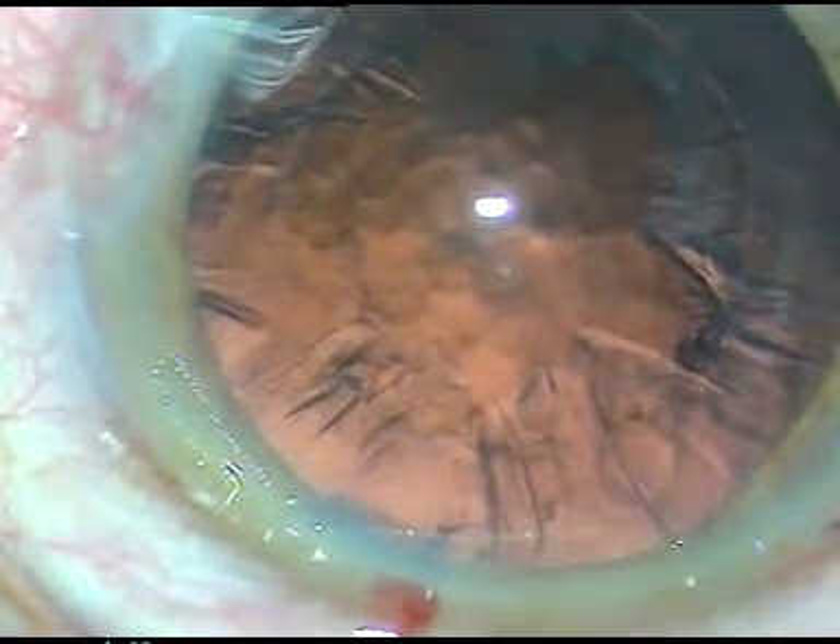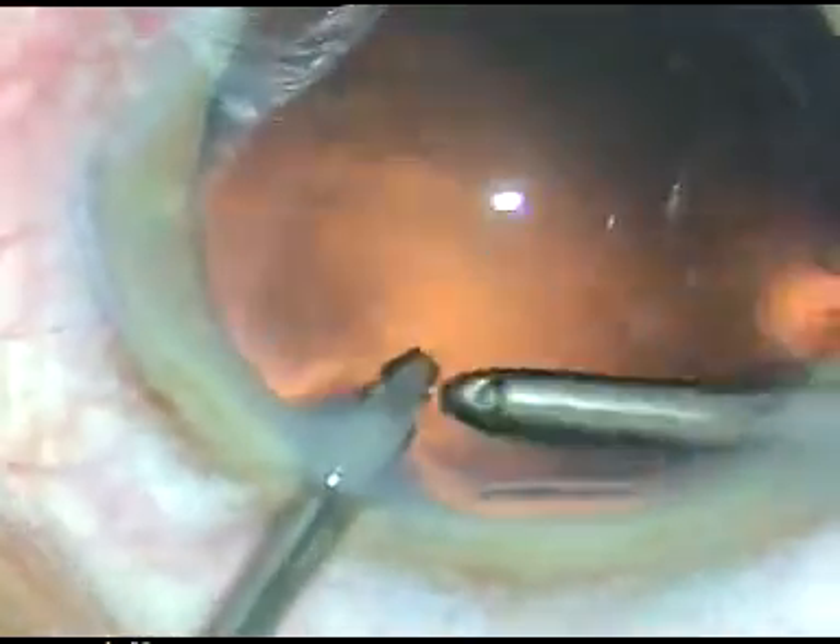I take the bi-manual irrigation/aspiration. I remove a little bit of viscoelastic substance, irrigate from the 8 o'clock side port, and aspirate the cortical matter with the aspiration probe. I change the probes — now irrigation is from 1 o'clock. I go through the 8 o'clock side port and remove the cortical matter which is there on that side.